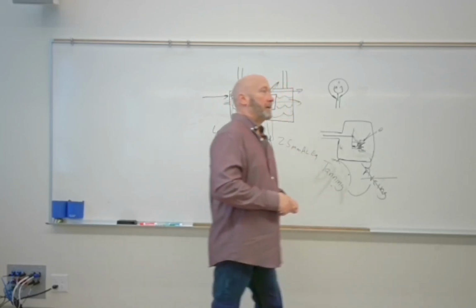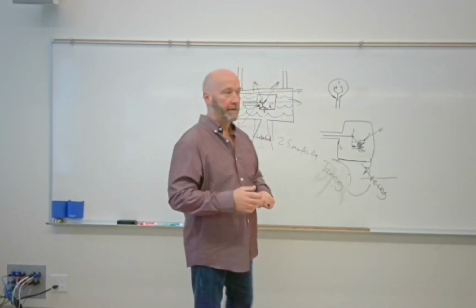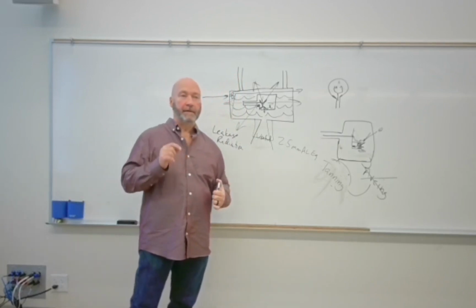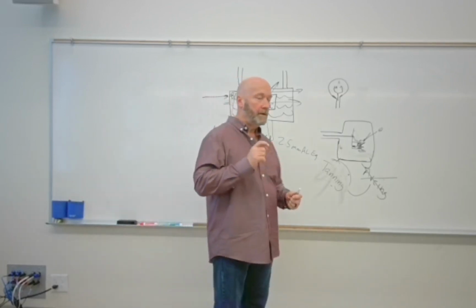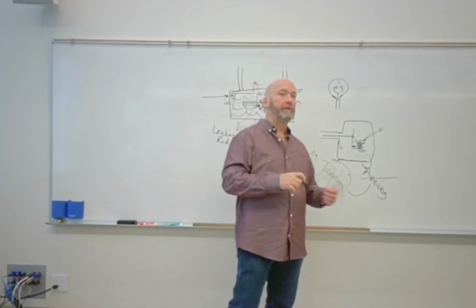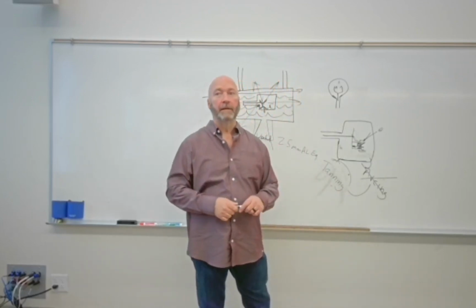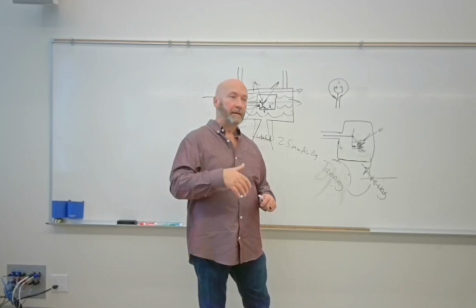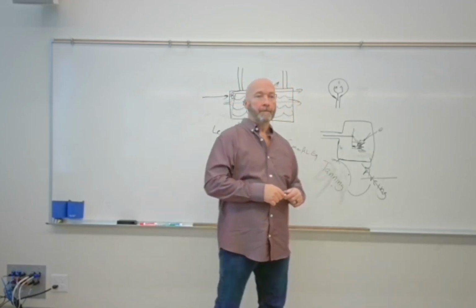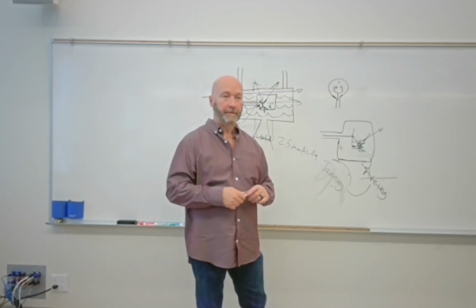So here's a couple of questions that are specific to filament size that you may run into. Most of your X-ray tubes are not going to allow you to make an exposure on small filament above 200 mA, because it's a small filament. You put too many electrons on it, you pop your filament. You burn it out too quickly. So most tubes will limit you to 200 mA or below for small filament. You can shoot with any mA station on large filament, though.